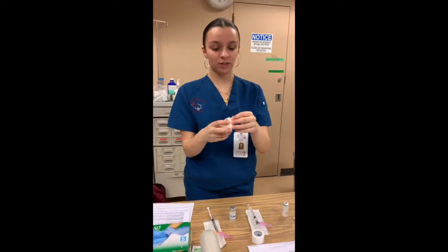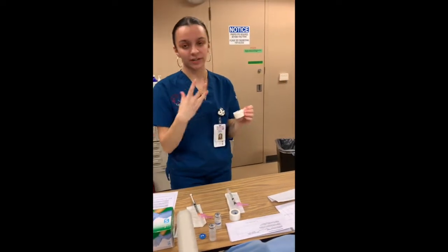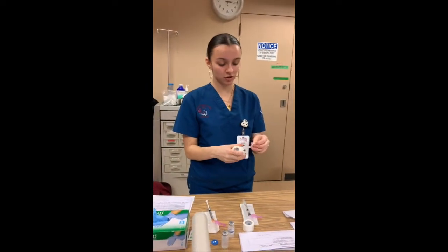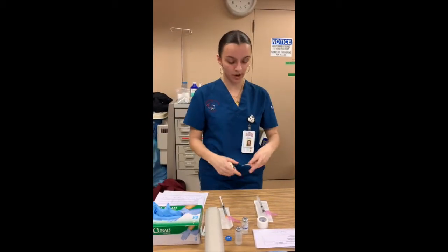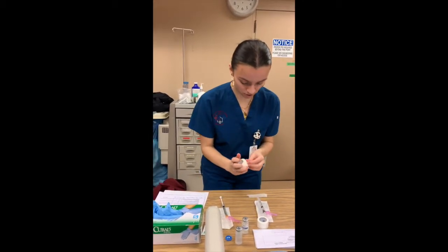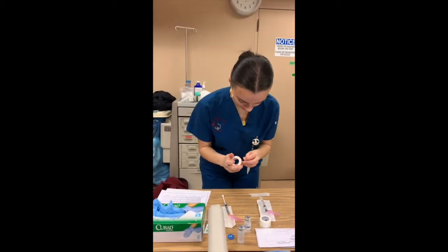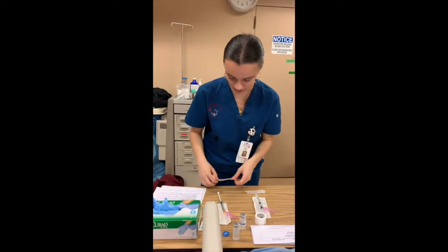Okay, now what I'm going to be doing, I'm just going to be making sure that for identification purposes and for safety measures, just going to be taking a piece of tape for each medication, and I'm going to be writing the name, the drug, and the dose just around that. So what I'm going to be doing first, I'm going to be doing the heparin, which is the subcutaneous.